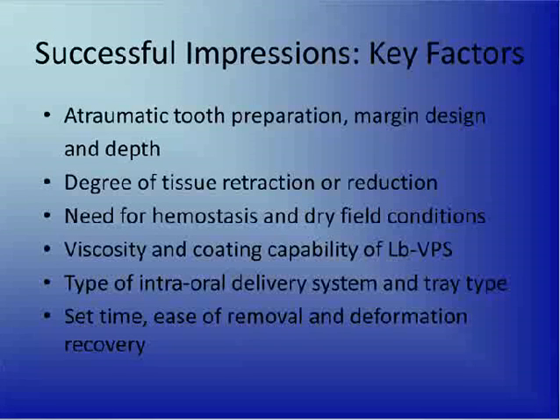The hydrophilic nature of impression material is made only through the proper chemistry and production of the VPS, because generally speaking, it's inherently hydrophobic. But certain wetting factors which are included will allow much better contact on the dentinal surface, because dentin includes about 60% collagen and water, so it's a very aqueous type of material.